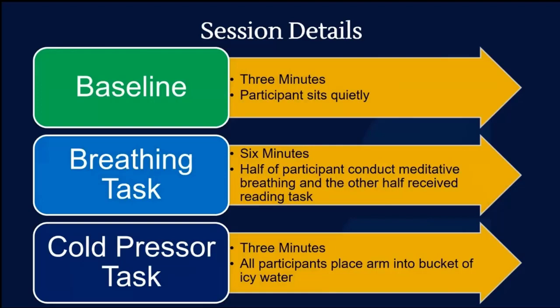Typically this is done simply by having them sit quietly. Some baselines are reading something of very low cognitive workload so they can just relax and get down to a normal state. Simply coming into the lab can induce a little bit of stress in some people, so getting all that done even before the baseline is helpful as well. But in this case, we did a 3-minute baseline. We collected ECG, and the baseline will let us get that starting point for everybody.